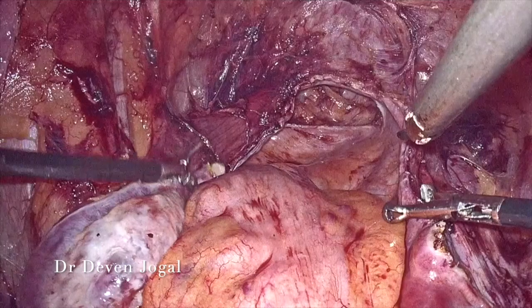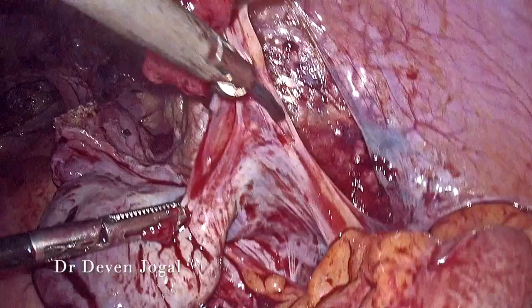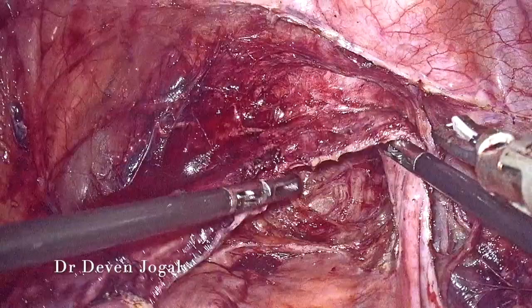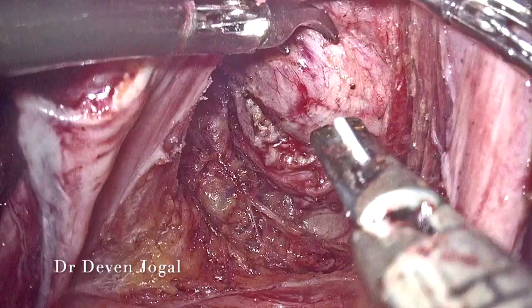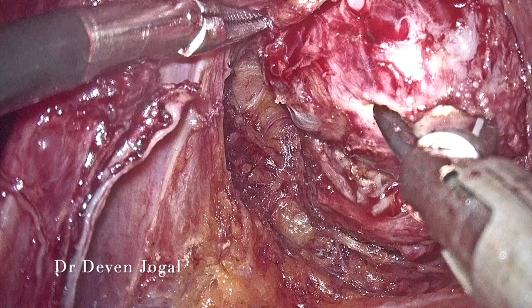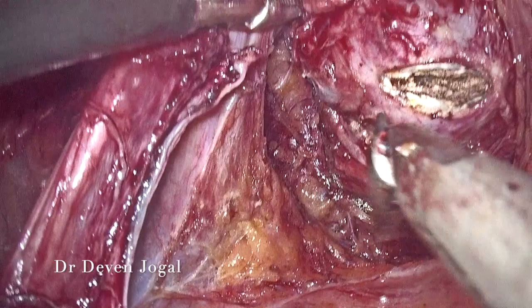After adequate mobilization on both sides, you can appreciate that both peritoneal folds are able to come to the midline, meeting each other. The incision was given on the most prominent part, which was then extended laterally on top of the sponge on a holder.